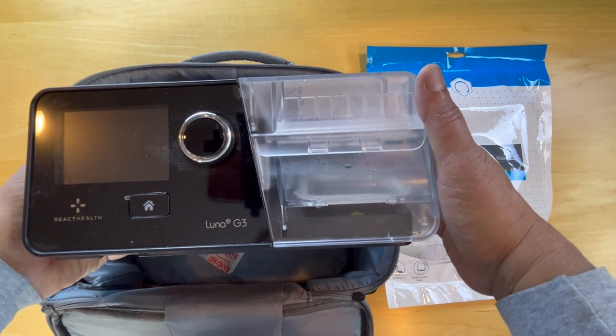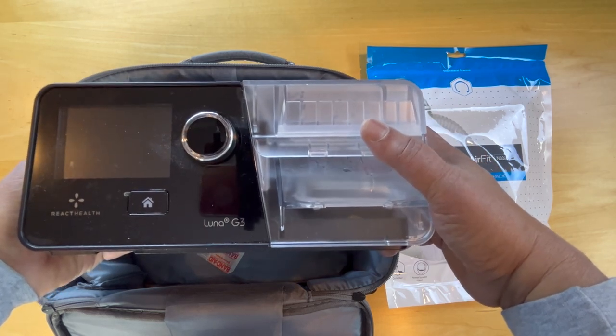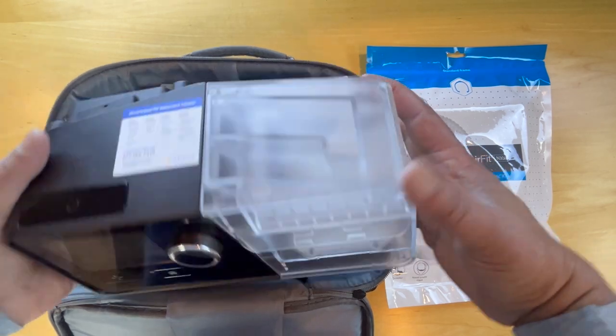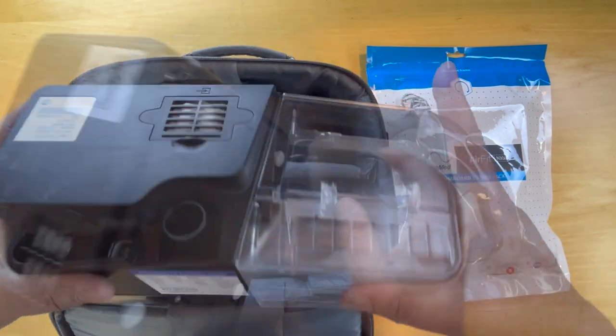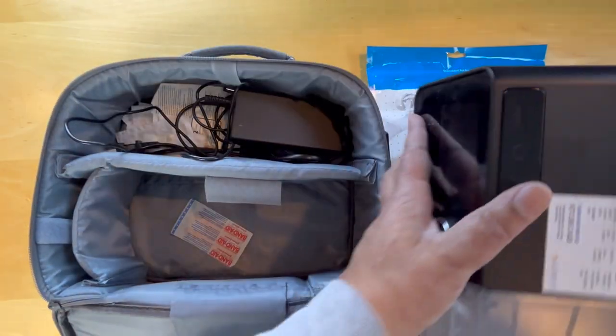It contains a water tank and a device here. We'll look at that in a second. Let's put this aside for that.